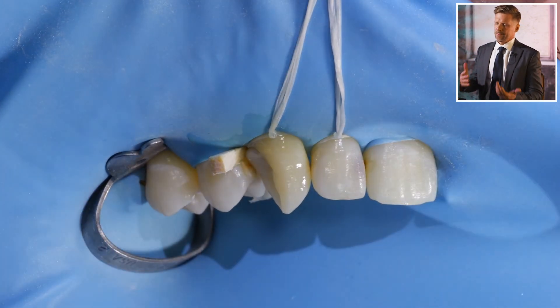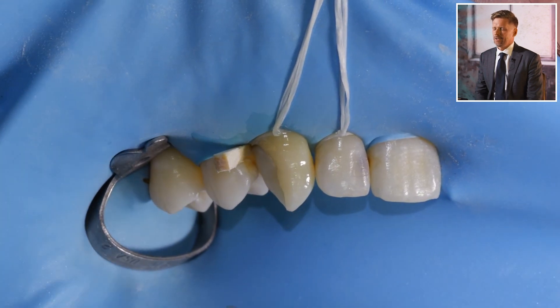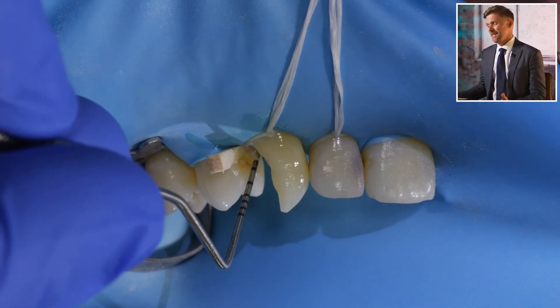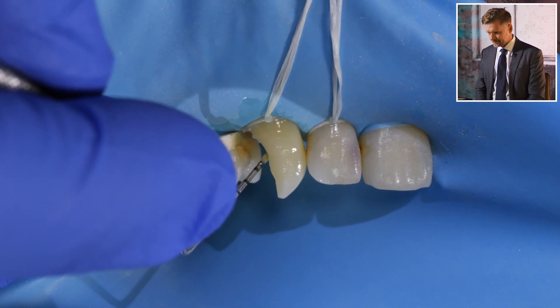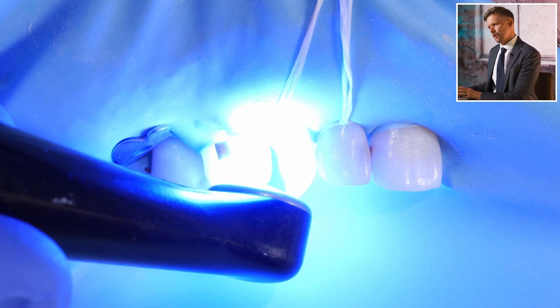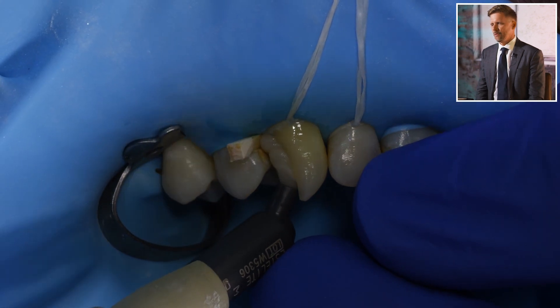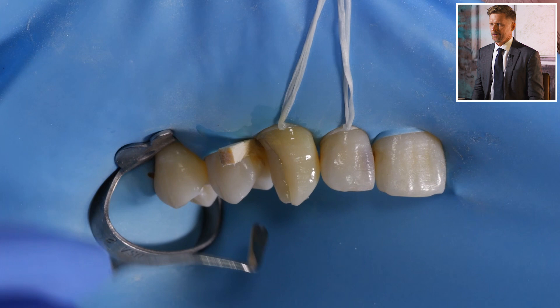I'm doing a centripetal build-up — you do the dentine layer first, build it out to roughly the right size, then cover the entire thing with the enamel layer. But as soon as I start putting this in without a matrix, it's clearly gray — looks awful — so we take it out. When you're experienced, you recognize quickly when something isn't working. Now we're getting some opaque resin to cover that dark area, because regular flowable won't cover the blackness of the dark dentine.